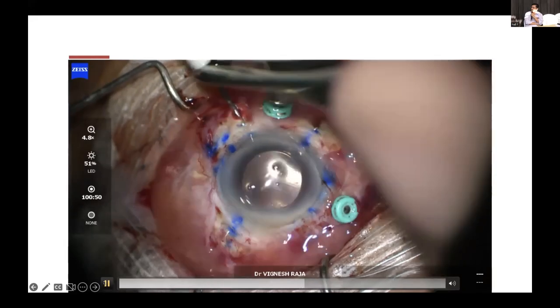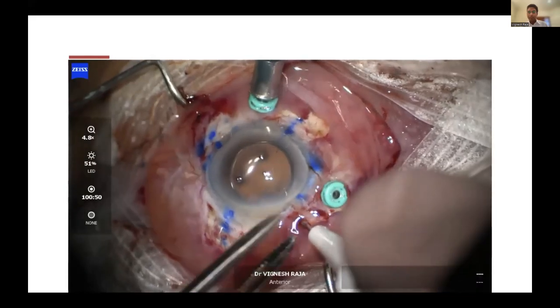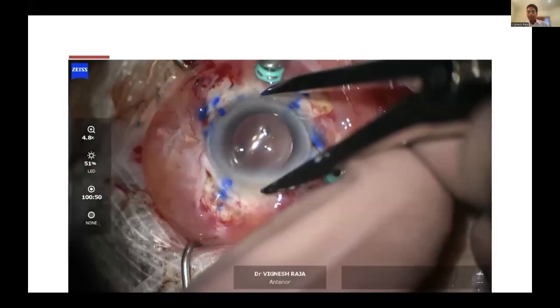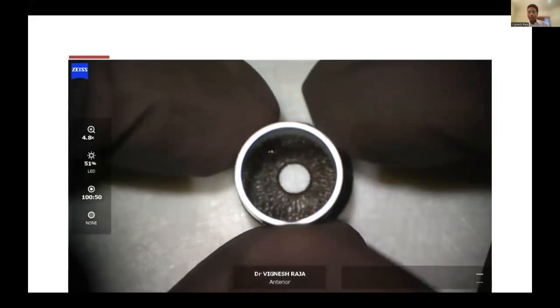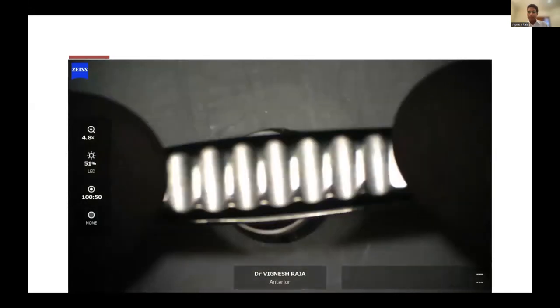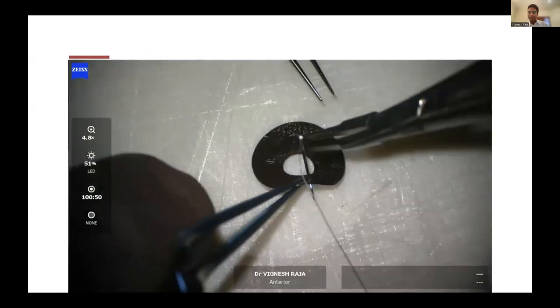And now I'm going to do another sclerotomy, 2 millimeters from the limbus, but 4 millimeters apart, so that I can put the artificial iris with the fiber. I'm measuring the vertical white to white, and going minus 0.5 millimeters from that. Again, we have to make sure that we press the trephine with the fields moving, so that you don't get a cut which is haphazard.